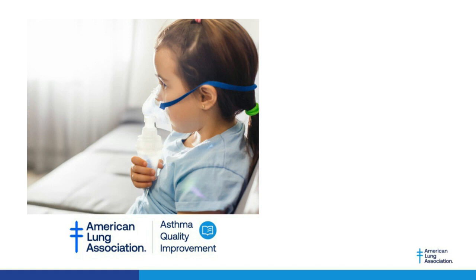Like in that particular case, I really wanted to do the spirometry and the full PFTs because this patient was highly symptomatic, having lots of trouble with their breathing, and it just proved to be a big stir up of their asthma. We have other patients that showed a decreased diffusion, which suggests there's a possibility that there's something interstitial going on in their lungs.